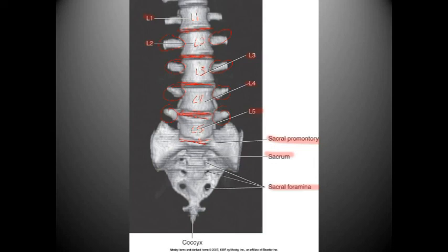Also, one thing that I forgot to mention is that the lumbar spine has 5, but I've seen several instances where you have 6 lumbar vertebrae, and that's usually because one of the areas of the sacrum, or S1, has not actually formed with the sacrum correctly, and so it kind of tricks you into thinking that you have that being L5 instead of the true L5. And so the rule of thumb there is I usually just scan all 6 of the lumbar vertebrae, because you're trying to get all of this area. So you want all of that area, or as much as you can get.